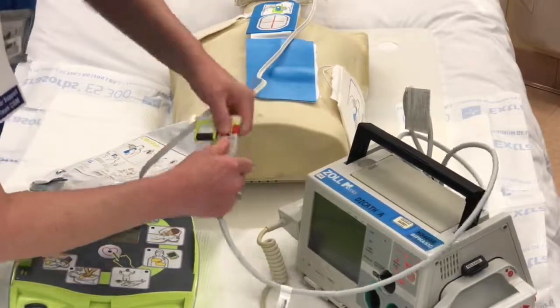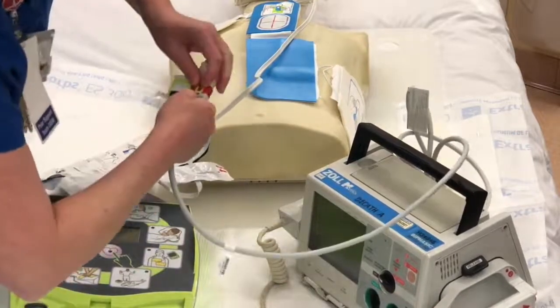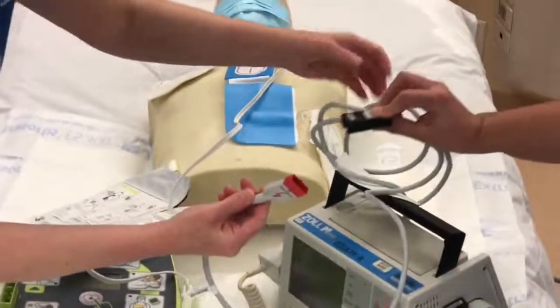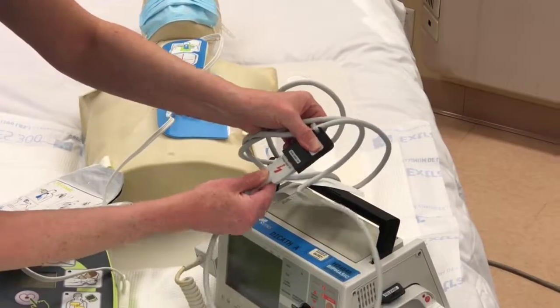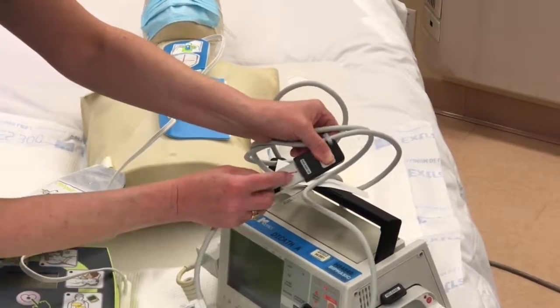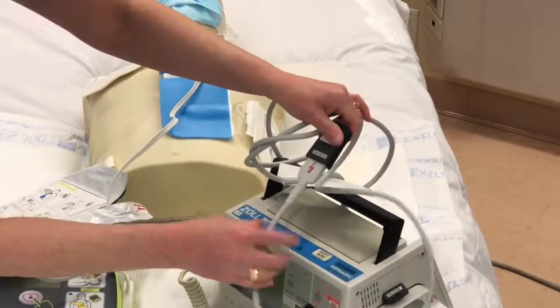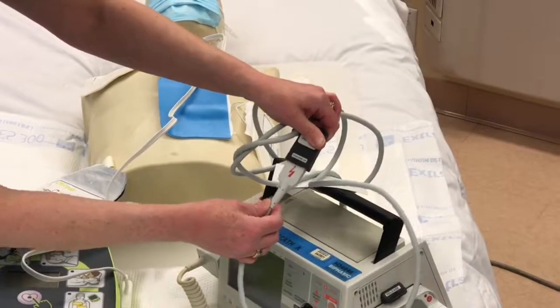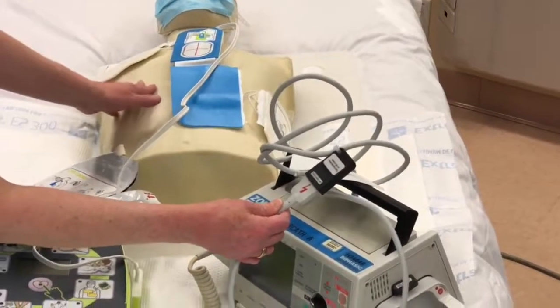If your device does not have seated paddles, you may also find that the multifunction cable is sitting in the test plug. And you'll note the "this side up" message with your shock symbol. So you are looking for the cable with the shock symbol in order to connect your patient to either the pads that go with the M-Series or the Zoll AED Plus pad.